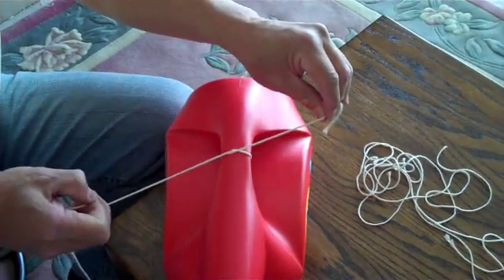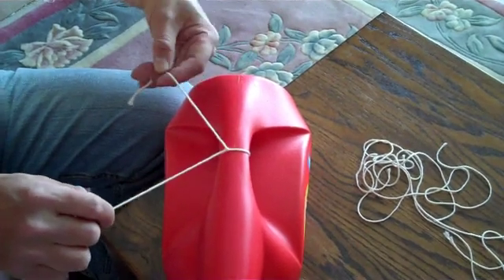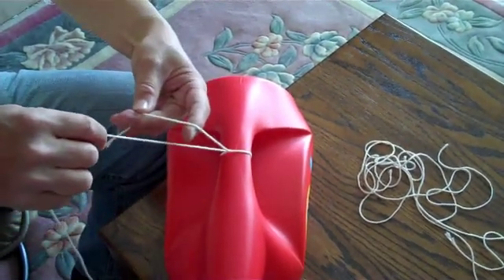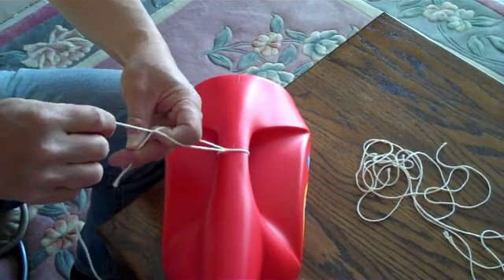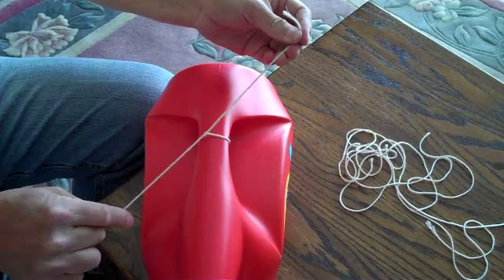Tie it up. That's the first knot. Second knot, same thing. Now you press and you use your index finger to hook it up this way. Tie it down like that.